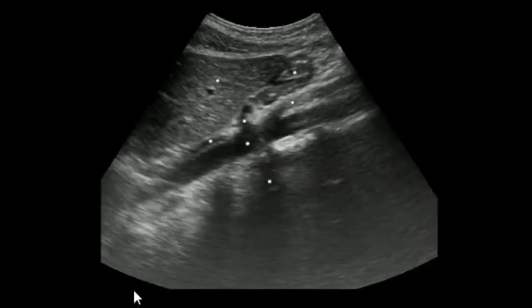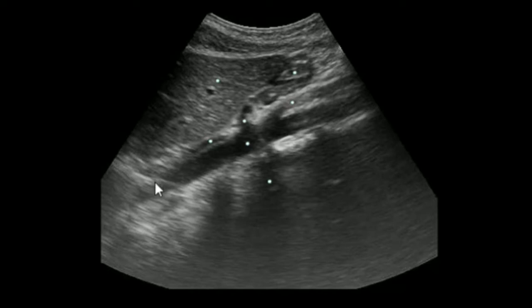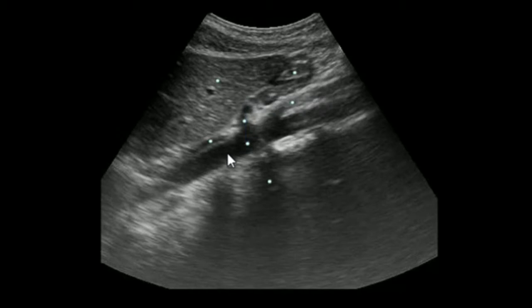This image shows the longitudinal section of the aorta. As we know, the spine is lying posteriorly. The aorta is anterior to the spine. The first anterior branch of the aorta, the celiac, and also the second branch, the SMA — superior mesenteric artery — are very nicely visualized.